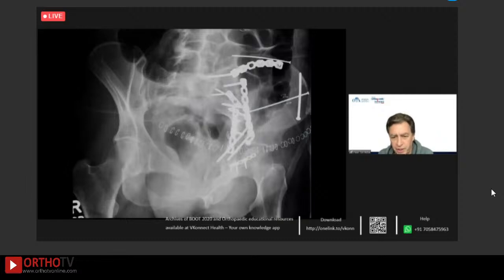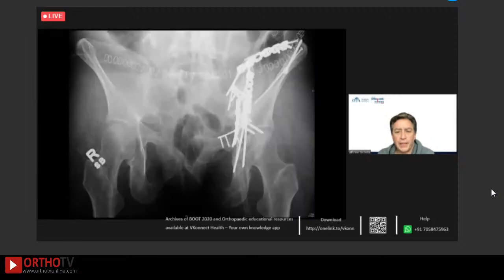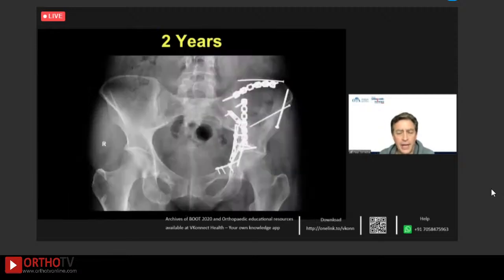So these were my views. You can see there's that little bit of step in the front. So there's a mild incongruity that I couldn't make any better. Maybe you guys could have, I could not. I was actually thrilled that I thought maybe she had a chance at having a hip. And here's her inlet and her outlet views. You can see we did fix across the SI joint, which was also unstable. But overall, I was not unhappy with it.